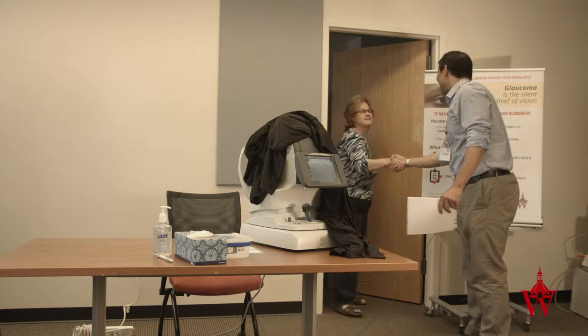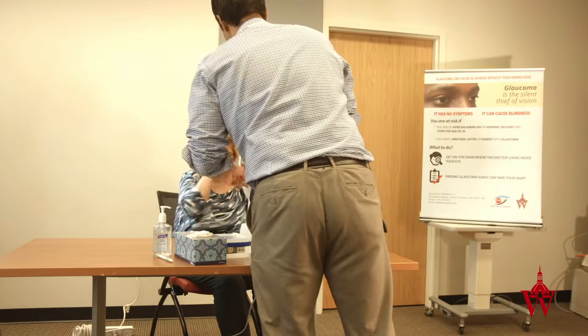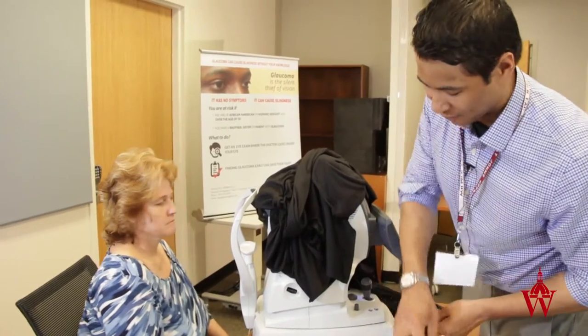Hi, Ms. Tina Siena. My name is Chris. Nice to meet you. Thank you for coming to our screening today. You can have a seat — please take your glasses off for me. I'm going to clean this machine off. We're going to be taking some pictures of your eye. Thank you, let me dry this off for you.